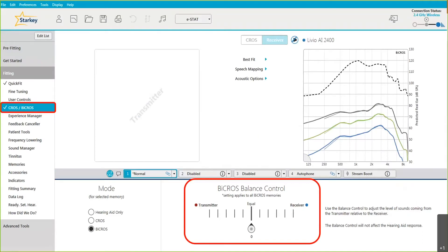If you fit in BiCROS mode, in that memory you have the option to use a balance control. When programming the hearing aids with the Livio CROS system, it is automatically streaming from the transmitter to the receiver while you're actively programming, so you can check with the patient to make sure it's coming in balanced. Think of it as a seesaw — if you go up on one side, it goes down on the other. Each tick on the slider is one dB up in that direction and one dB down in the opposite direction.